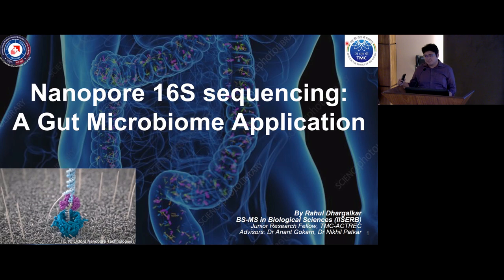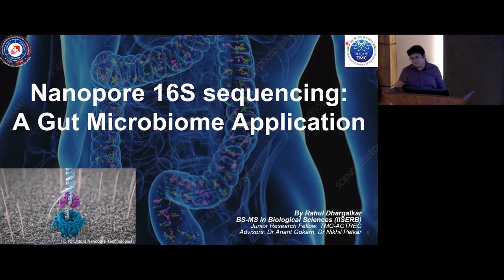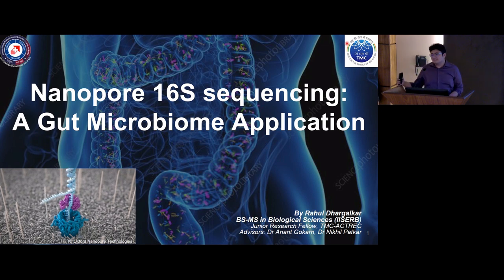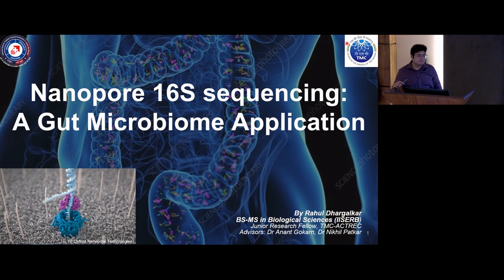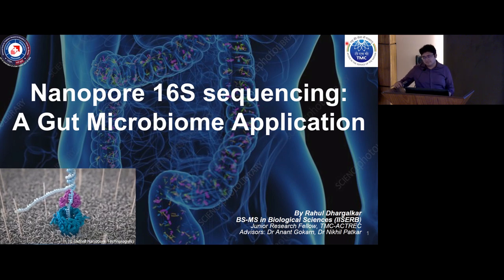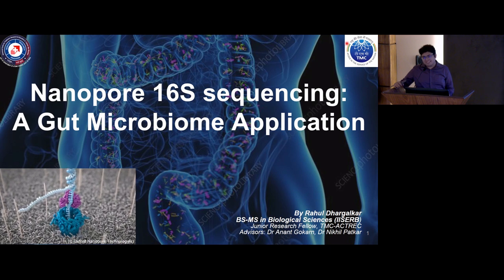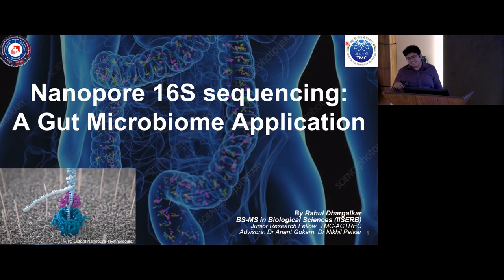So we're working with St. Jude's on this. They say using adaptive whole genome sequencing, within 36 hours of receiving the leukemia sample in the lab, you can give an end-to-end report. So if you ask me, this is going to revolutionize all kinds of diagnostics, at least for leukemia. You can not only detect translocations, you can detect ploidy, chromosome gains and losses, you can even detect FLT3, you can detect TPMT. That's the thing. Cheaper, it should be in the ballpark of still 15-20,000.